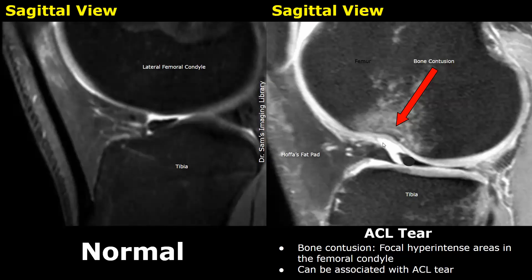Bone contusions or bone bruises can be seen in some trauma cases affecting the knee. They will appear as focal, hyperintense bright areas inside the bone. The bright areas are due to hemorrhage and edema. These bone contusions can be associated with ACL tears.